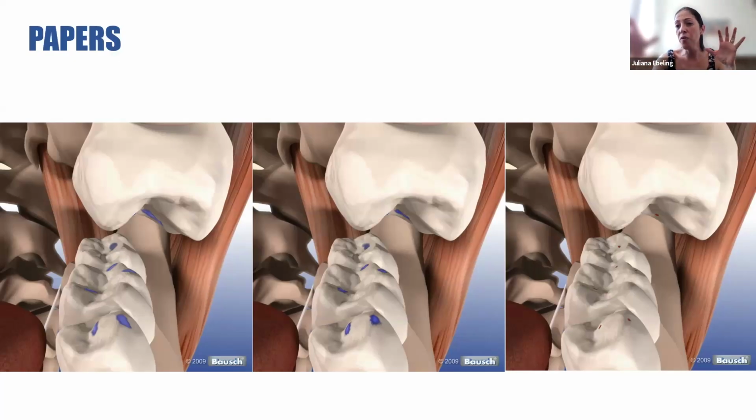If I have a very smooth surface, normally these thinner papers don't work because the surface is so smooth that we cannot fix this tint, and so we normally combine.